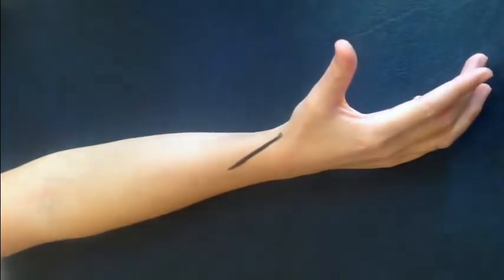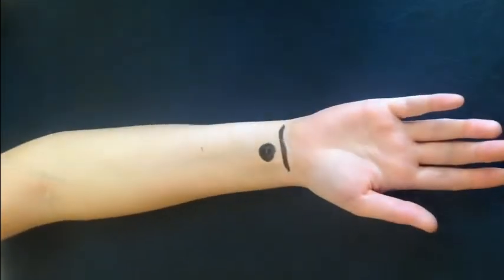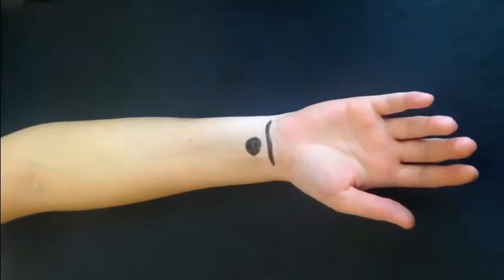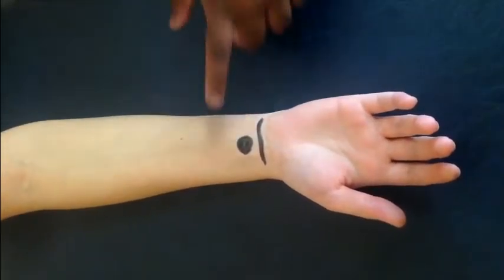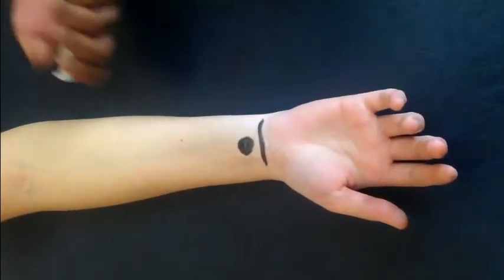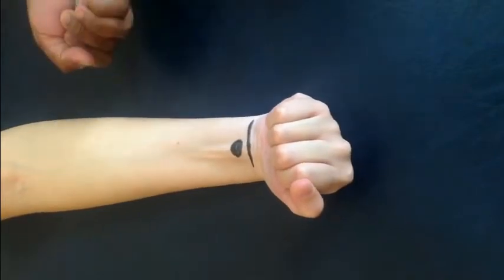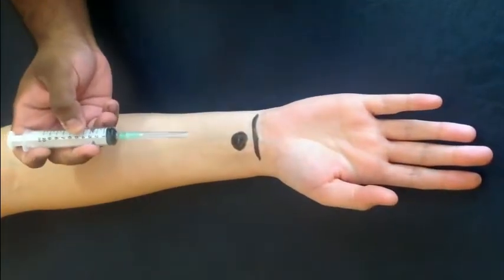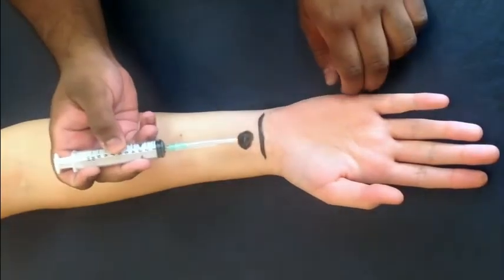Moving on to carpal tunnel syndrome. Here you want to use the volar aspect of the wrist. You identify the tendon, and using an angle of 30 to 45 degrees, you insert your needle.